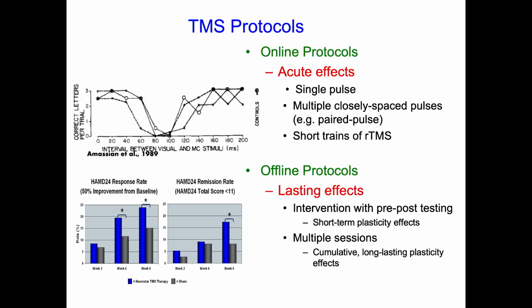Okay, so given all those parameters, I'd just like to talk a little bit about the basic TMS protocols that we use. They're kind of divided into two separate kinds of protocols. One is online protocols, looking at acute effects. The other is offline protocols, looking at lasting effects.